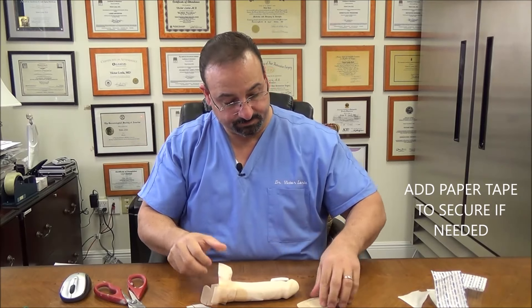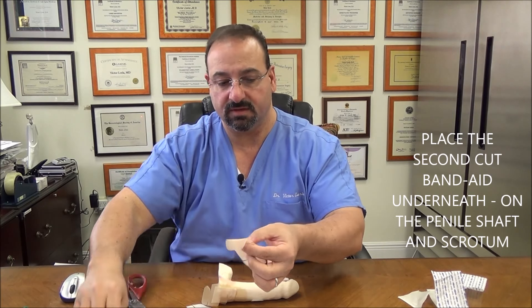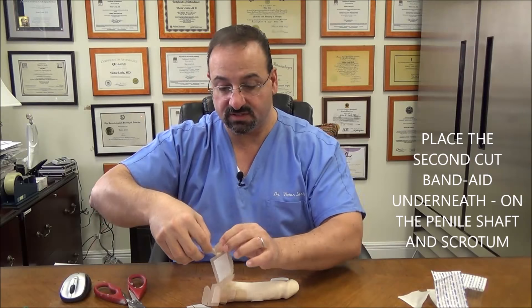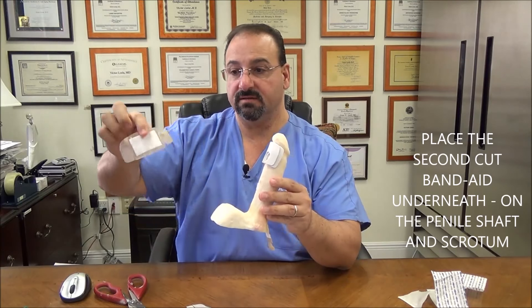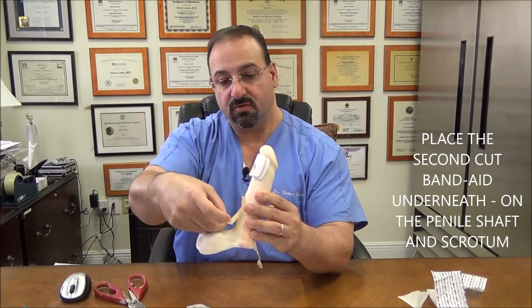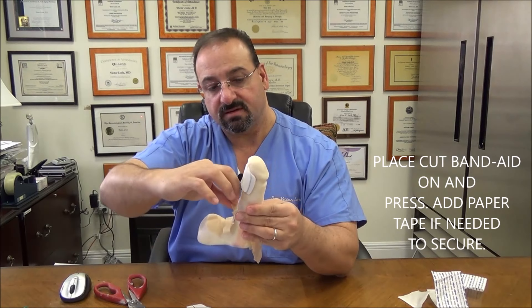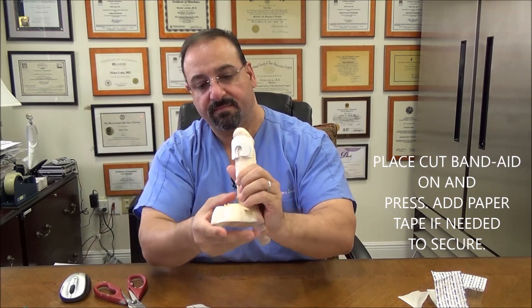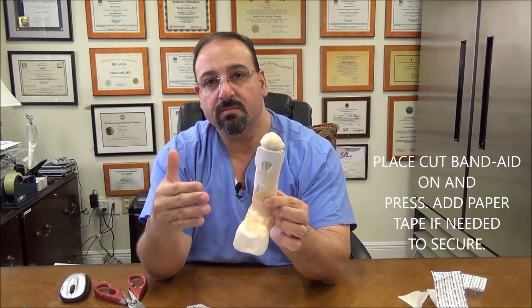Now let's do the second band-aid. Carefully remove it. This is where it's very, very important, because these cuts are more important for the underside area here. This is where you're going to put the band-aid — on the scrotum, the shaft, the base of the shaft, and the scrotal area. Move this right into that joint and press it in nice and easy, let it stay flush. That is how it's going to curve onto the area. It'll be better seated when the other components are on to put pressure on it. So you have your band-aids on.